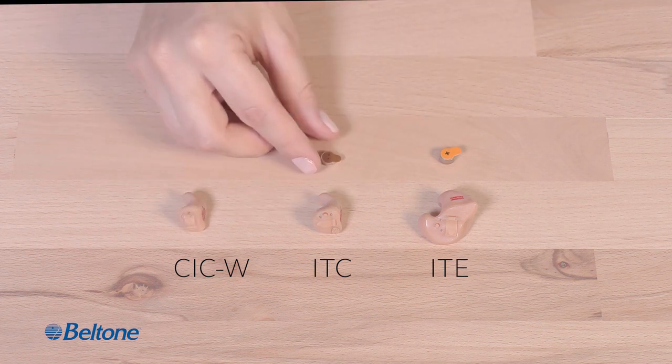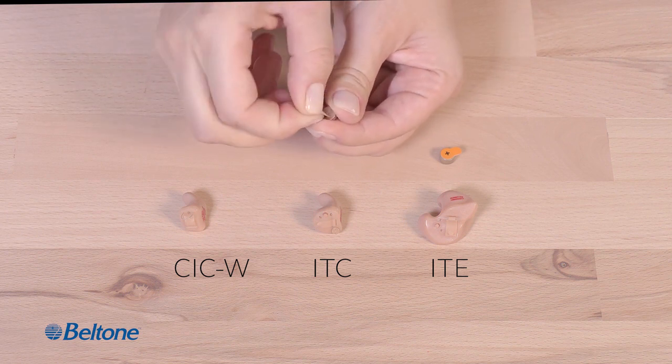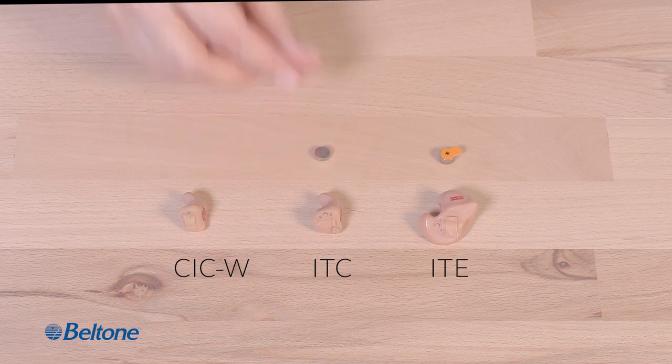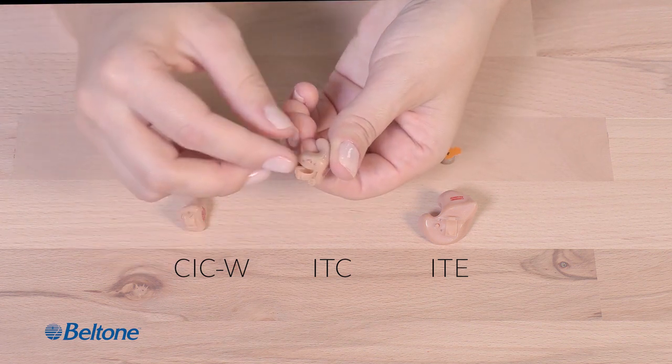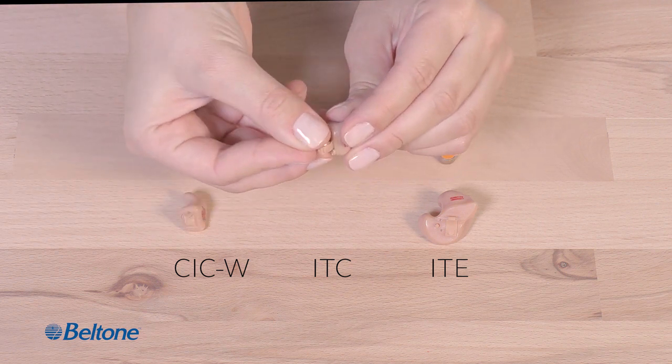They remove the backing from battery 312 and set it back on the work surface. They pick up hearing aid ITC and pop open the battery compartment. They insert battery 312 into the open compartment tray and then slide it closed.